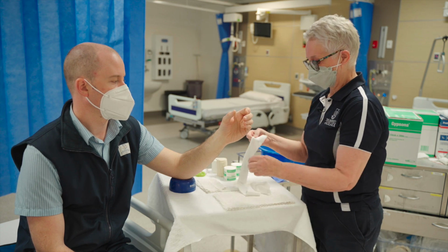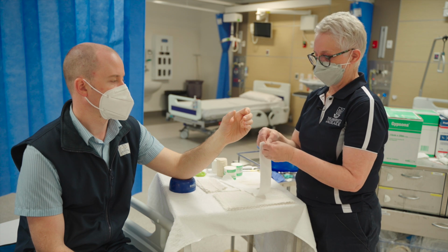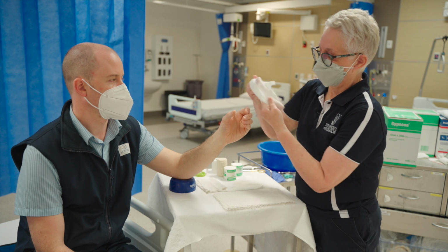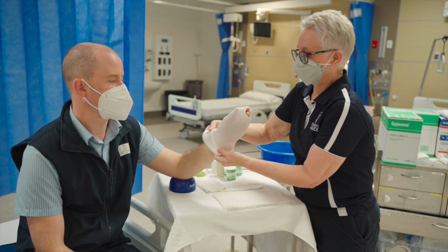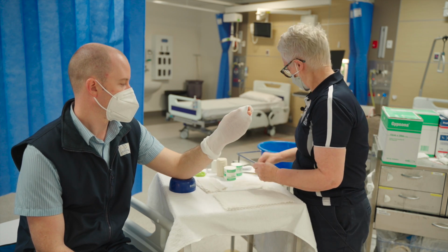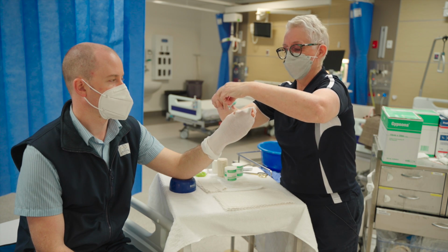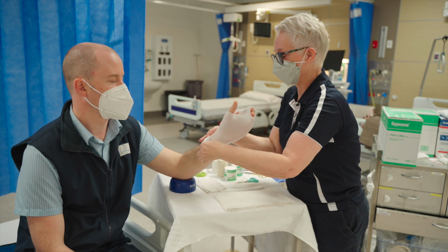Next we take our stocking, which is a size 2, and again we roll this up to slide it over the hand. If you lose position, it's quite all right. You can put that bandage right back where you had it. That's not a problem. So we take this up to the middle, give it a little twist, and make a hole. We then pop the thumb through.